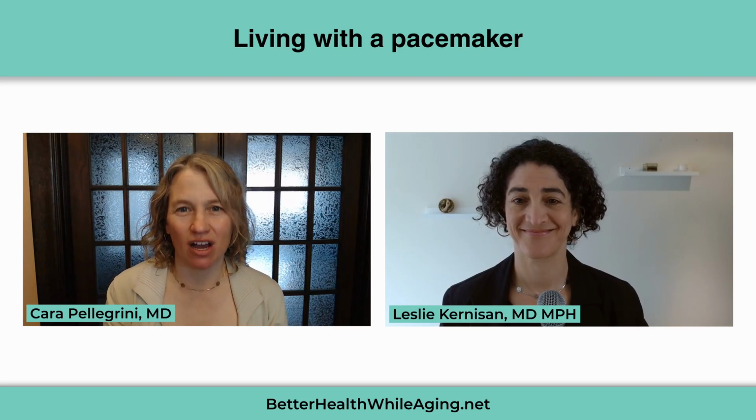Usually after you get a device, you're given a little identification card that says you have a pacemaker, here's the model, here's the serial number, and hang on to that card. And it is possible, if you are lucky enough to travel and go to an airport, that a pacemaker could set off a metal detector, depending how it's set, or be noticed. So usually you just tell them you have a pacemaker and may or may not show them the card, and they may or may not wand that area. And that is perfectly fine and shouldn't disrupt the function of the pacemaker in any way. And hopefully shouldn't disrupt your travel plans too much either.